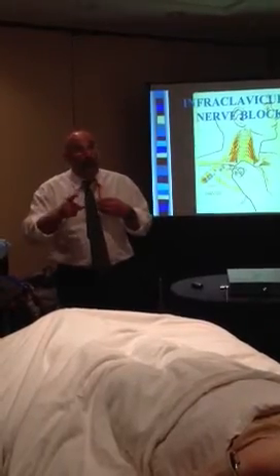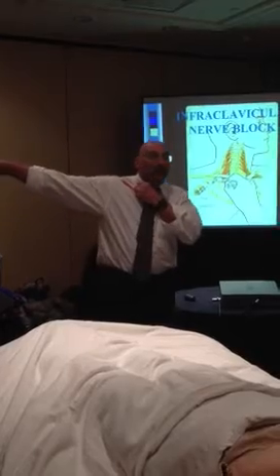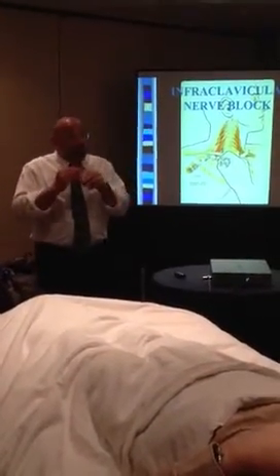Make mistake number one, which would be to map your landmark with the patient's arm at their side, but then abduct the arm to do the block. Now, why is that a problem? Remember, we don't want to be medial.